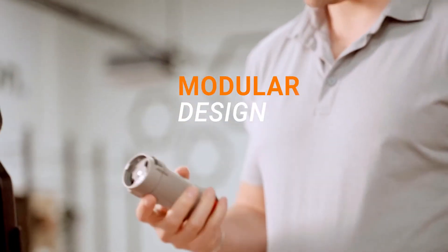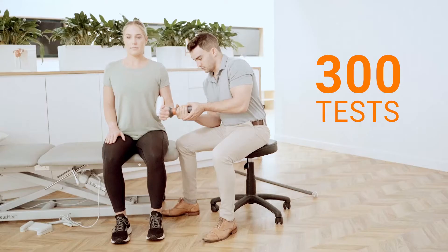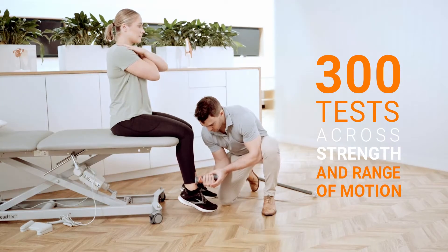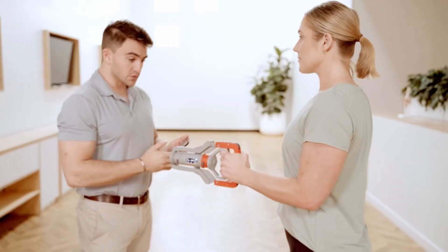A modular design makes it easy to configure Dynamo's innovative smart attachments, unlocking more than 300 tests across strength and range of motion for every major joint in the body — including grip strength, which has traditionally been measured by an entirely separate device.